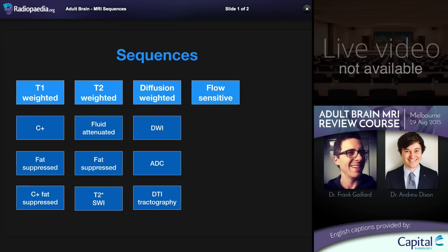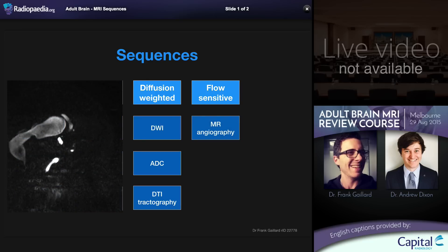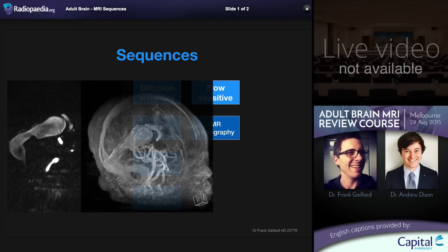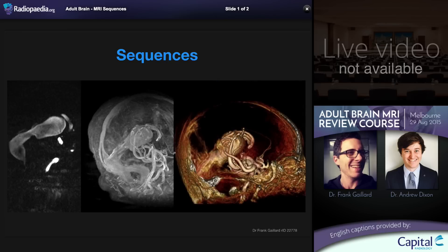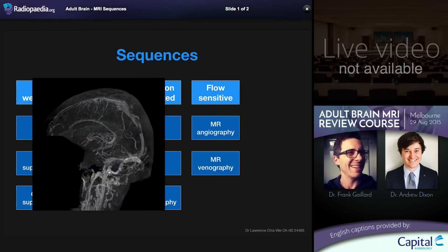Moving on to flow sensitive sequences, these encompass MR angiography, which is usually performed without intravenous contrast and relies on blood bringing signal with it. These can be shown as a stack of very thin images, but since there is little background context it can be difficult to localize structures on a single image. Thus these images are often shown as MIPs — here in the case of a young patient with a vein of Galen malformation — and can be surface shaded. MR venography can be performed similarly to MR angiography or by other techniques such as phase contrast, and can be used to image dural venous sinuses and cerebral veins.